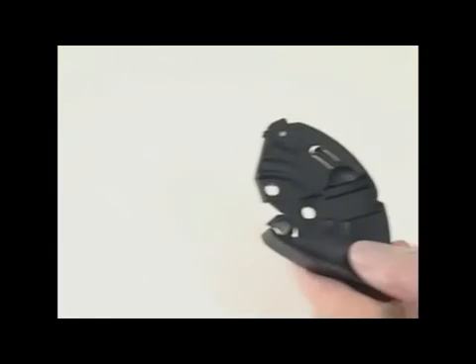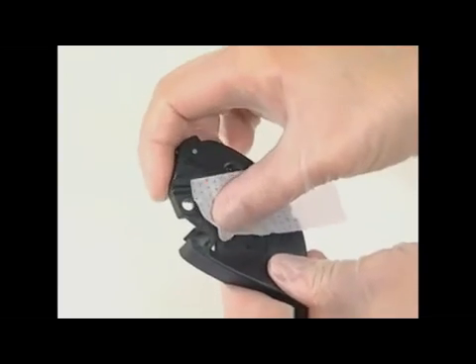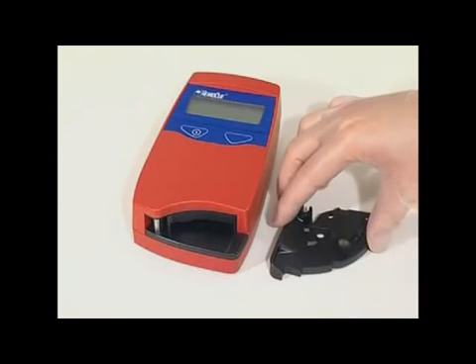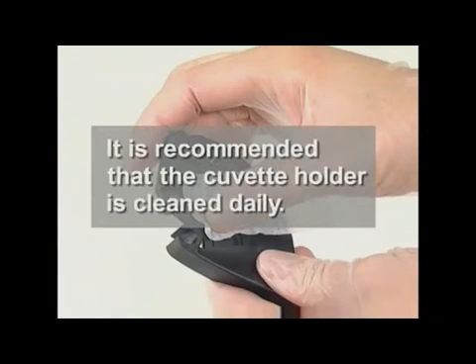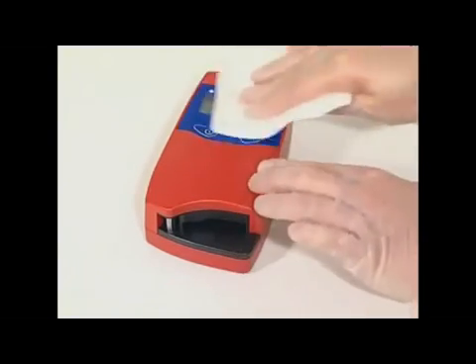Clean the cuvette holder with alcohol or mild detergent. The cuvette holder must be completely dry before being replaced in the analyzer. It is recommended that the cuvette holder is cleaned daily.